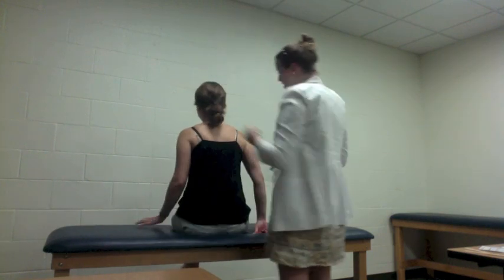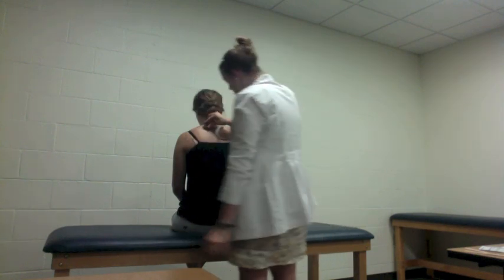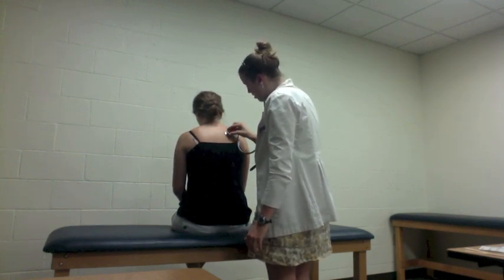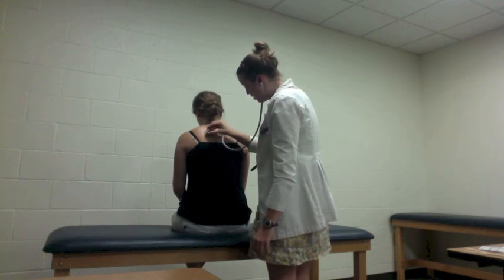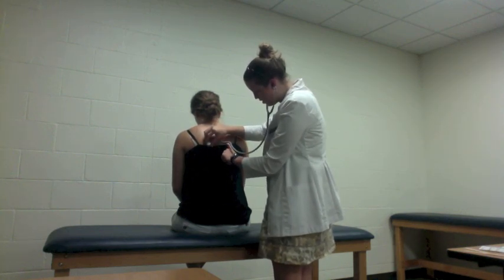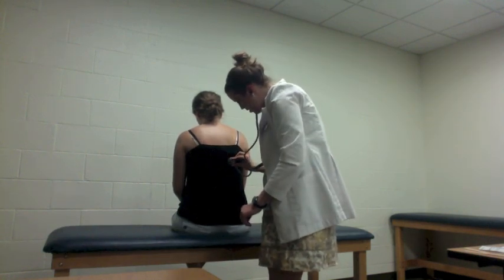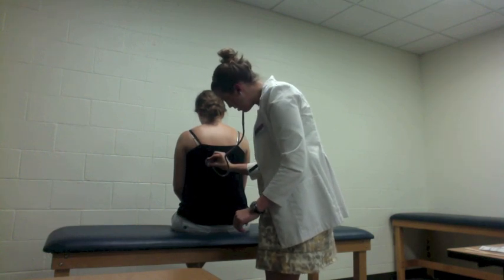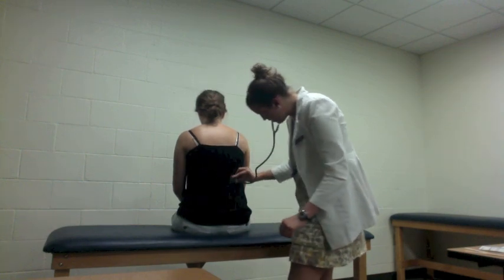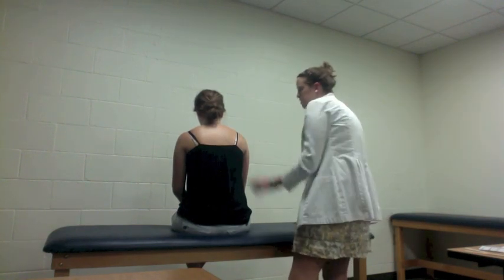I'm first going to listen, and then I want you to take a deep breath and breathe through your mouth every time you feel my stethoscope. Okay, ready? Good, almost done. Very good. Now I'm done listening, and your lung sounds back here sound very clear.